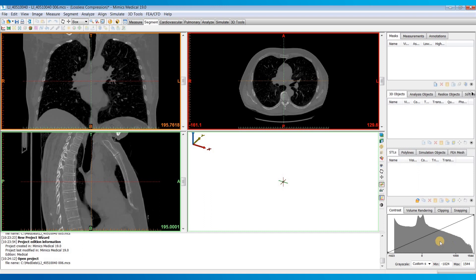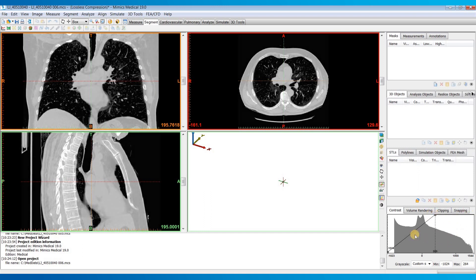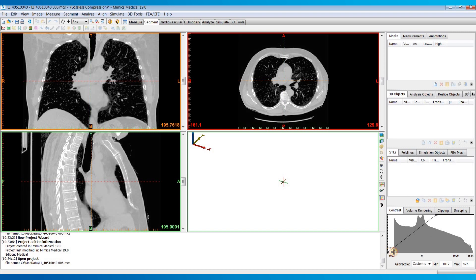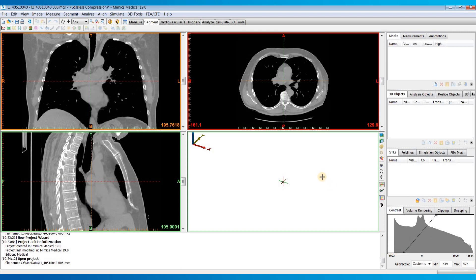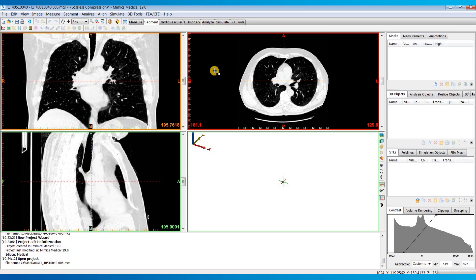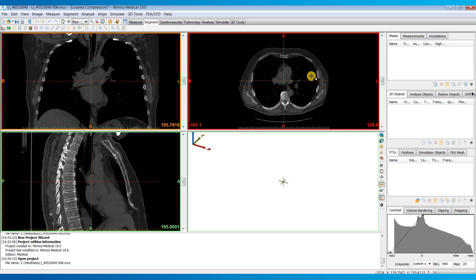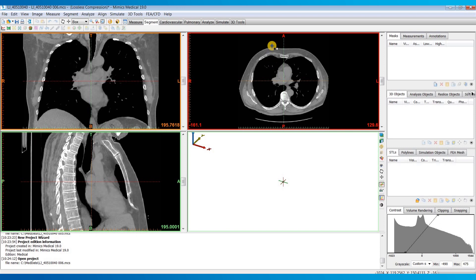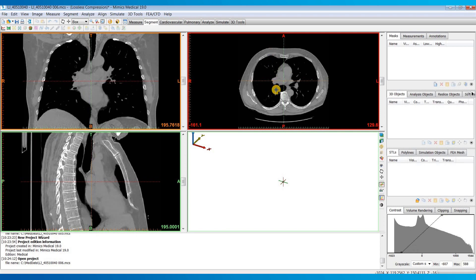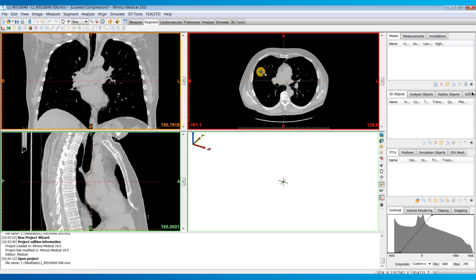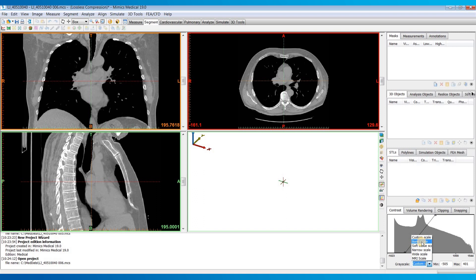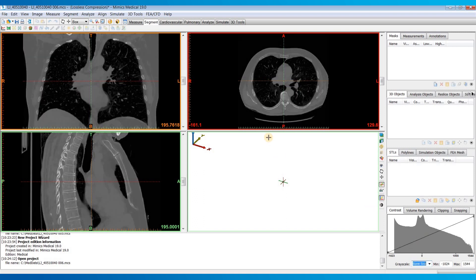Alternatively you can also hold down right click and drag your mouse left to right to change the brightness of your images, or you could drag your mouse up and down to change the contrast windowing for your images. There's also some predefined sets for CT scans. If you're going to be segmenting out bones you can just choose the bone scale. Same for soft tissue and the like.